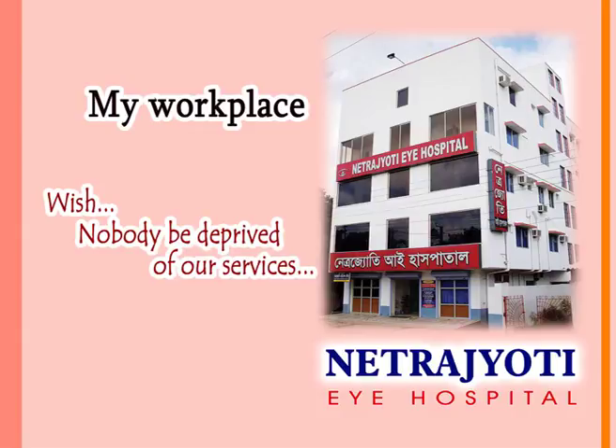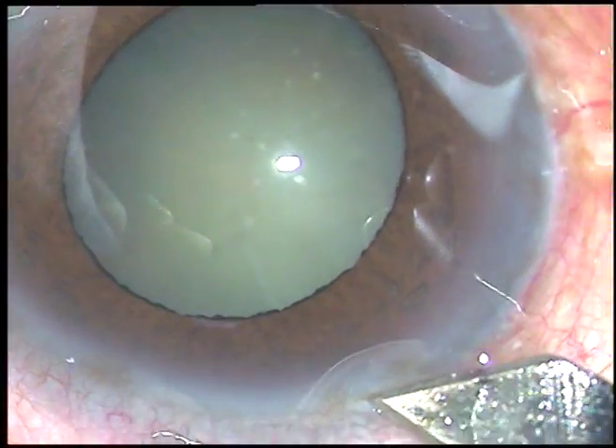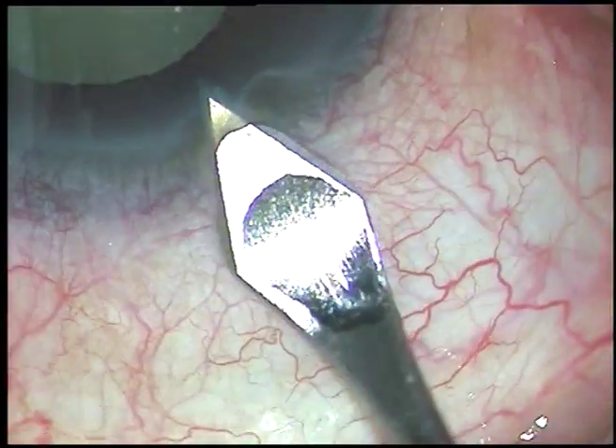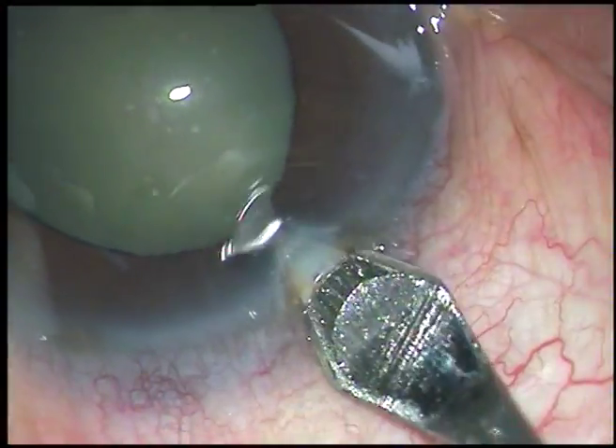Friends, welcome to my hospital at Ranaghat, India. This is phacoemulsification of a cataract with grade 3 nuclear sclerosis and a not well dilated pupil.